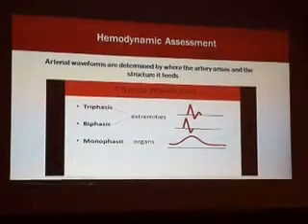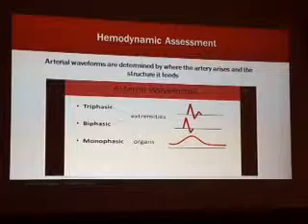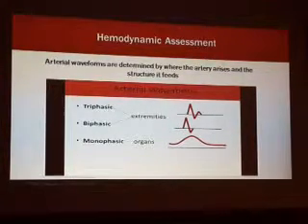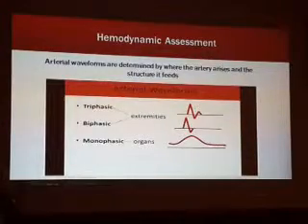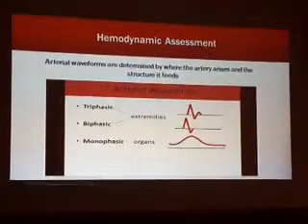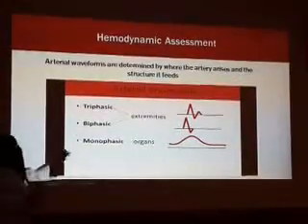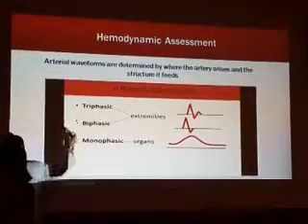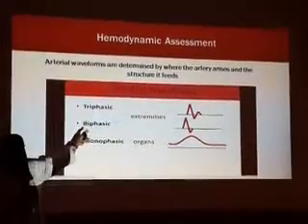عندنا طبعا كل waveform of الارتري يعتمد على ايه؟ يعتمد على الاورجن اللي it supplies. فإذا كان طبعا الرينال artery هيختلف عن الكومن femoral artery. هذا supplying organ kidney وهذا supplying peripheral. دائما عندنا الارتري اللي هي supplying الاورجن تكون monophasic flow، والperipheral يكون triphasic ويكون biphasic.